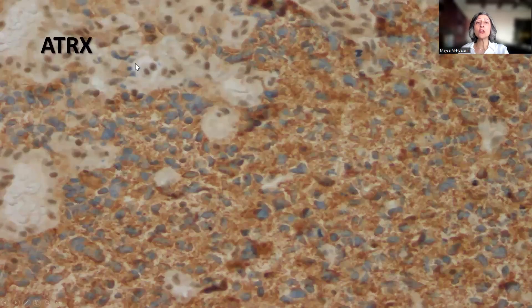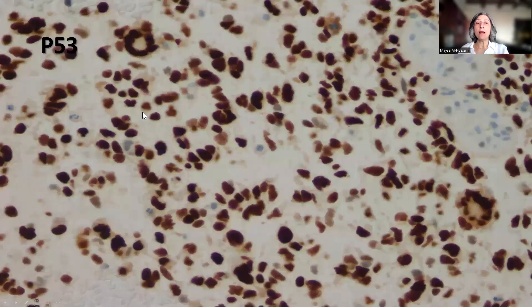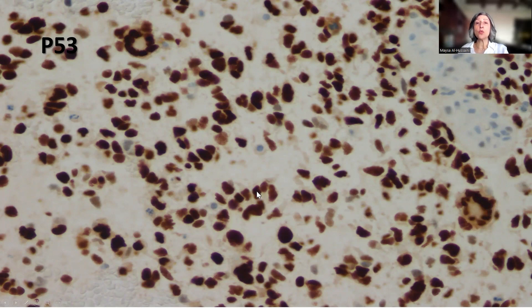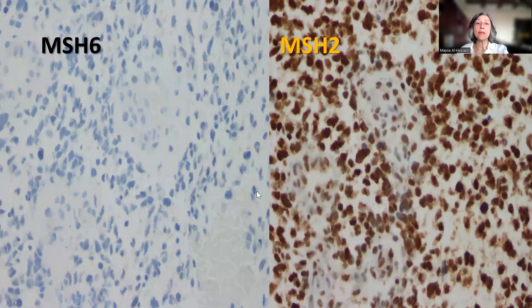The OLIG2 positive staining supports that this is a glial tumor consistent with glioblastoma. ATRX showed loss of nuclear staining in the presence of internal positive controls, which are the endothelial cells, consistent with mutant ATRX. P53 showed strong diffuse positivity in the tumor cells, including the multinucleated tumor giant cells as well as the mononuclear tumor cells.